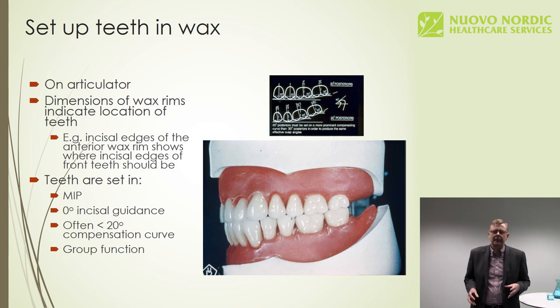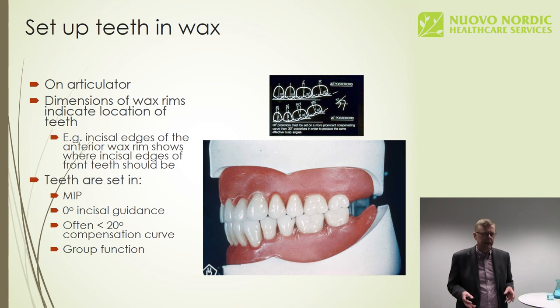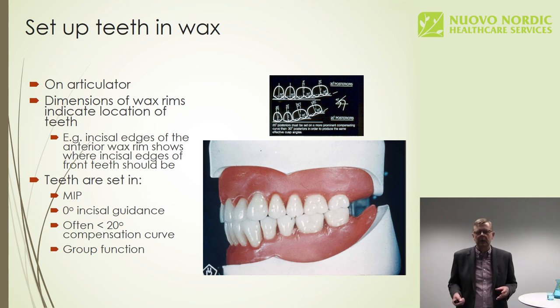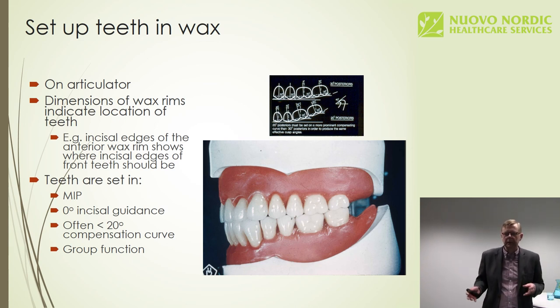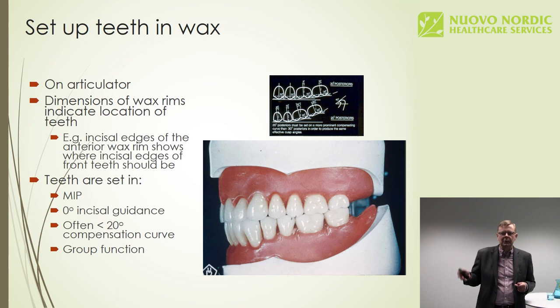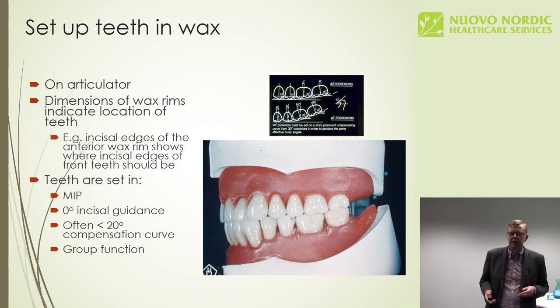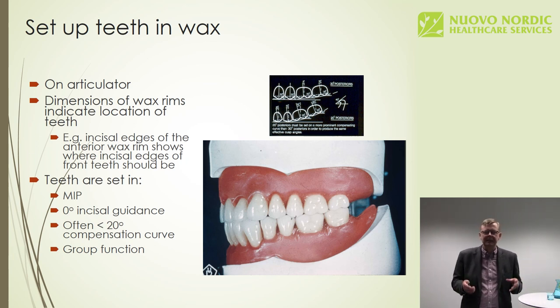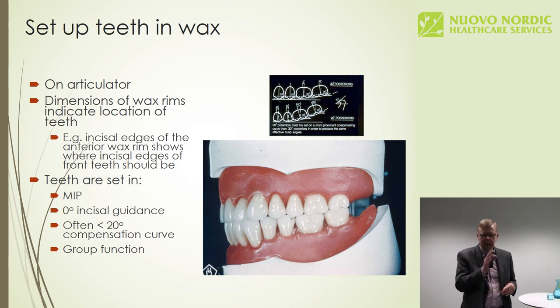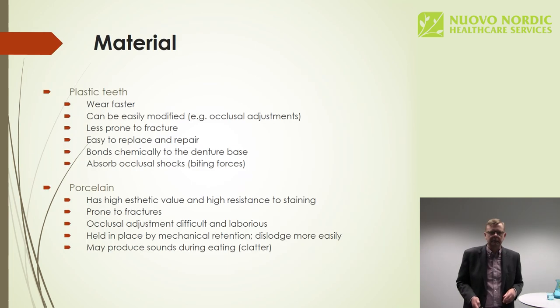Once we have fixed the wax rims, the jaw relation records together, it's time for the technician to set up the teeth. He'll do it on an articulator according to a set of rules. I'm not going to go into those details either. However, as you will see, the next time there will be teeth set up according to your wishes in the way you cut the wax rims. Everything should be there. The midline should be there, the planes, etc., etc.